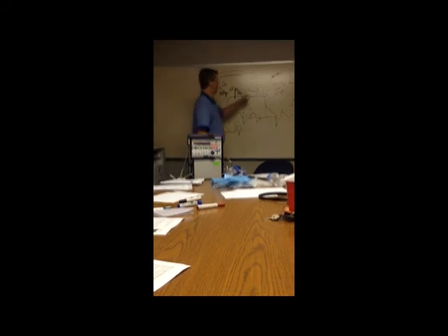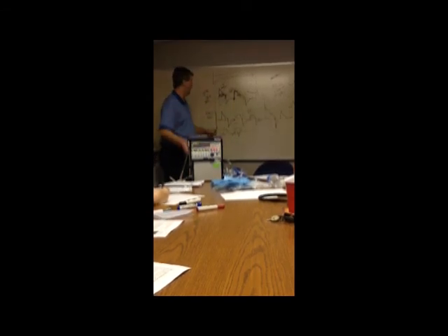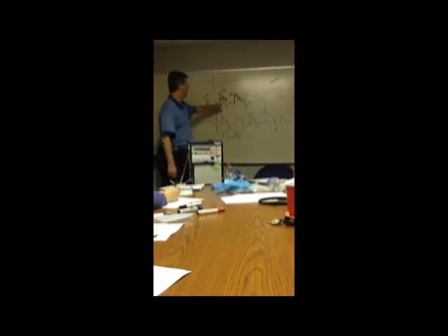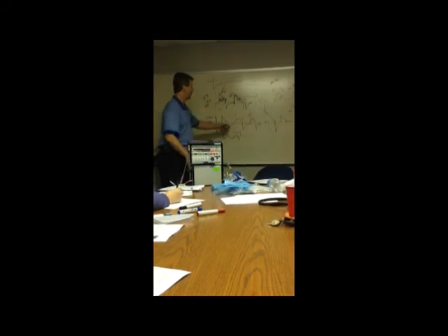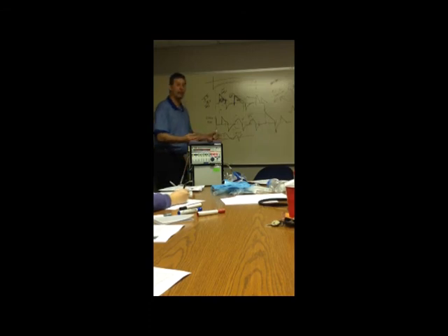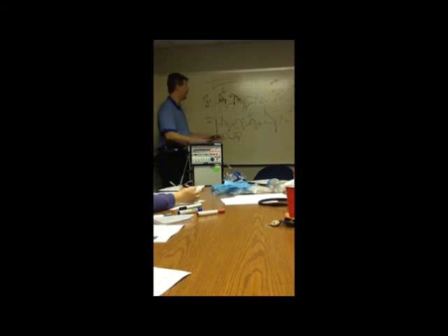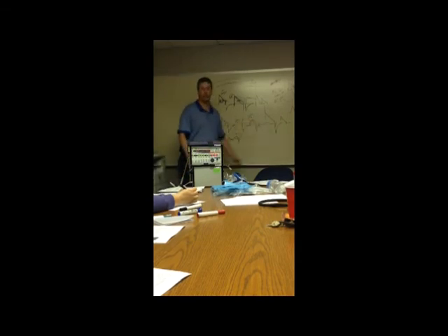Yeah. I'm going to end this real quick. So now you know about assist control with volume. The breath is a volume breath. Those are constant, pressure varies. You know about SIMV with volume ventilation. That's VC or SIMV/VC. Each machine breath is a volume breath just like this one with a set amount of air going in. Pressure varies. They can breathe spontaneously in between, either assisted or unassisted by some pressure support.